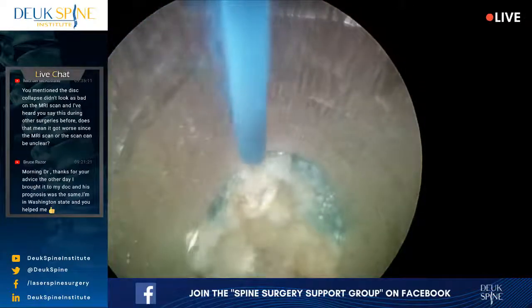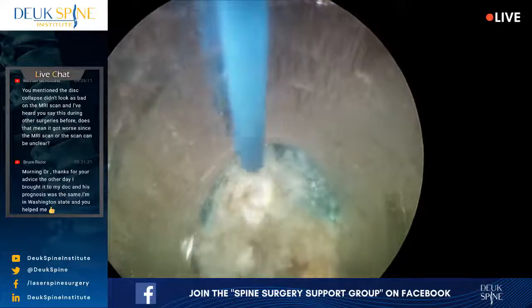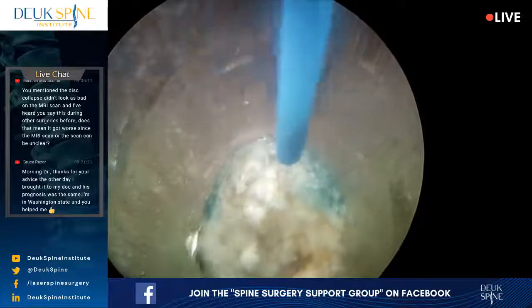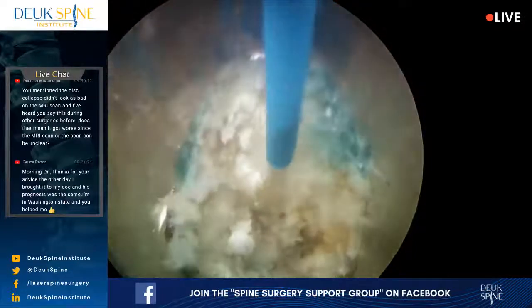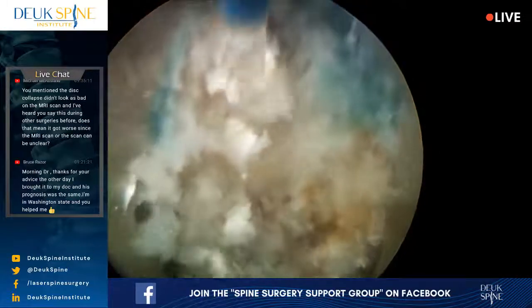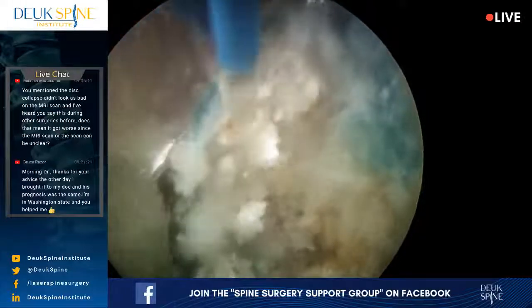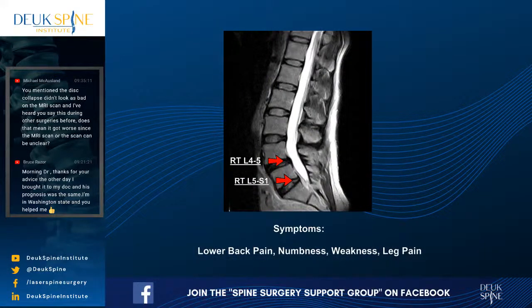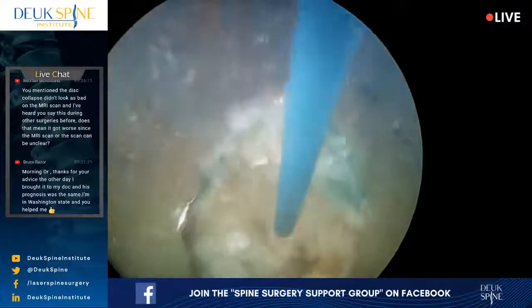A question from YouTube says, you mentioned that the disc is collapsed, but it didn't look that way in the MRI. Do you feel like it got worse since the MRI scan? Yeah, it's a great question. So the disc is collapsed. It's not normal. If you're looking at L5-S1, go up three discs and look at L2-3. L2-3 is a normal looking disc. That's not collapsed. L5-S1 is definitely collapsed compared to L2-3. And considering L5-S1 is the biggest disc, along with L4-5, it should be even taller than the L2-3 disc. So there's definitely collapse going on.